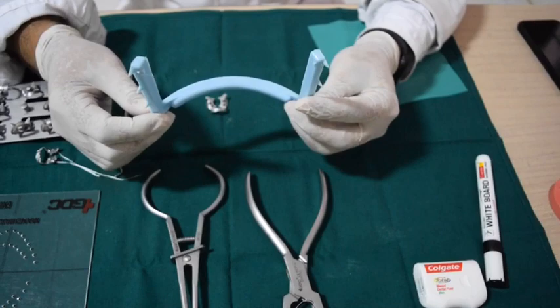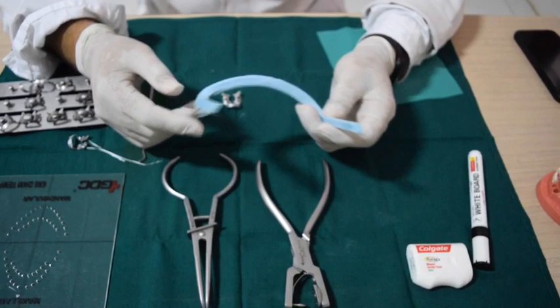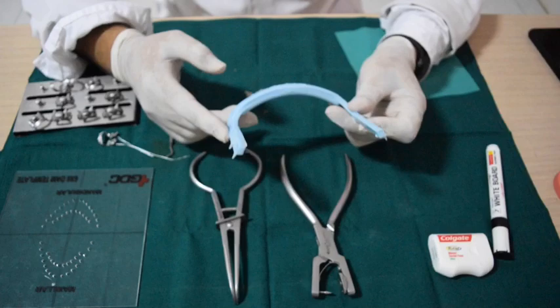The rubber dam frame is made up of plastic, and there is also a metal frame which is called Young's frame. It has got sharp edges which will help in securing the rubber dam sheet, and the concave surface will be facing the patient.